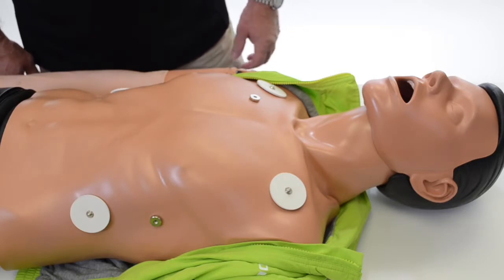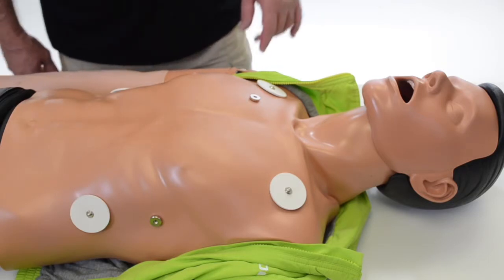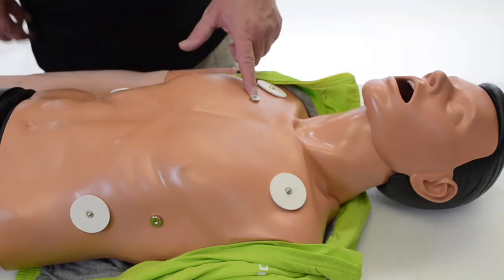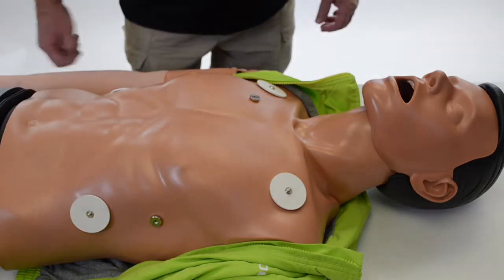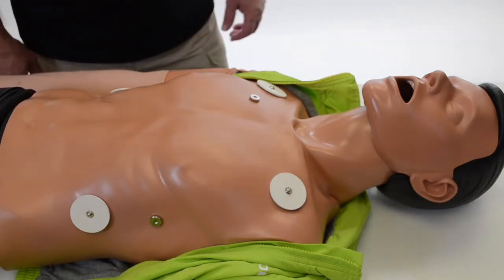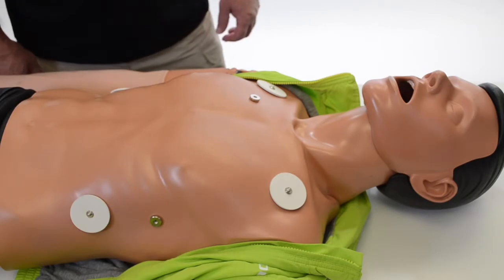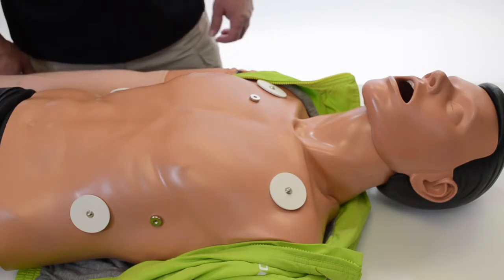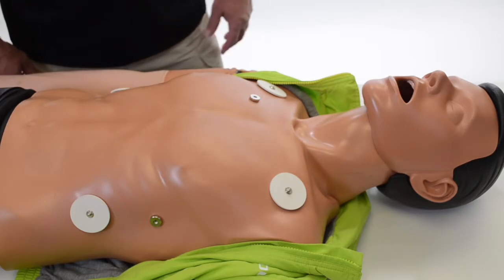With AED training, you have the ability to use AED pads and use those pads across both defibrillation posts. Both mannequins have a built-in wave generator with 26 rhythms, and both your AED or your defibrillator will pick up those rhythms and respond accordingly, whether it's to advise shock or whether it's to advise starting CPR.